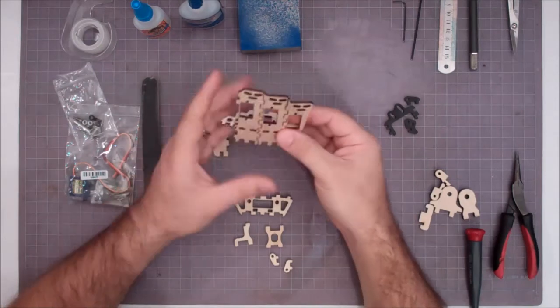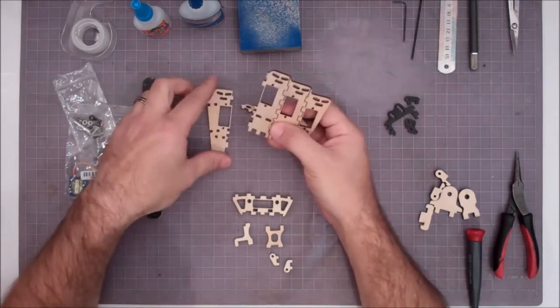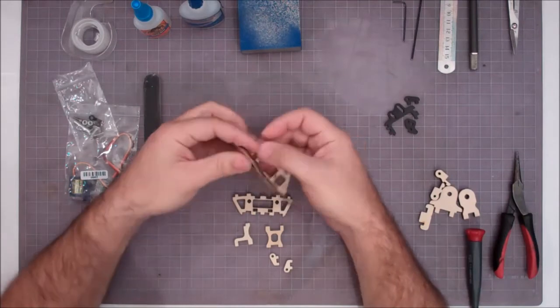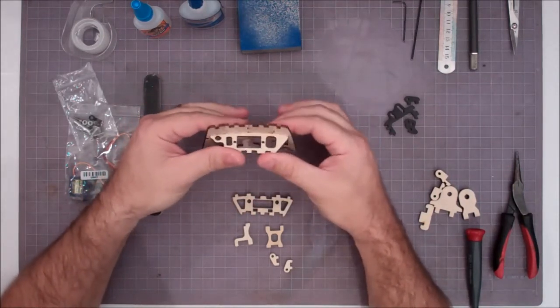So then we'll work on this outer plate. One on, and then I'll work on the thumb plate. And again, don't squeeze. Okay. All right. So that kind of lays in there.